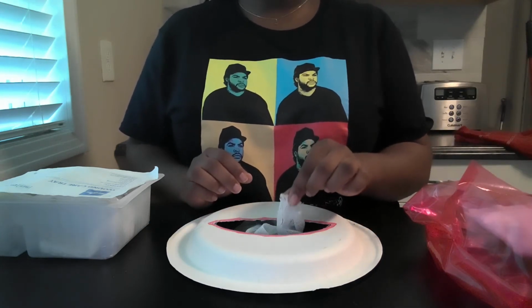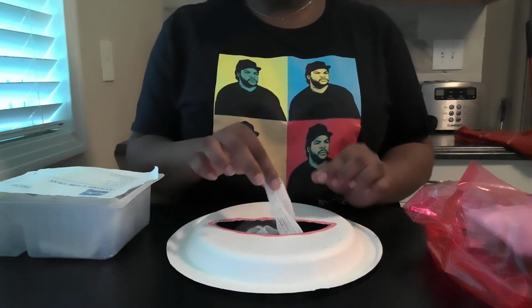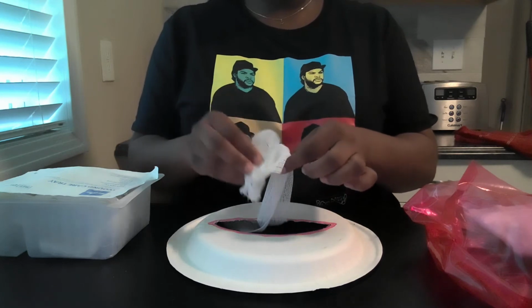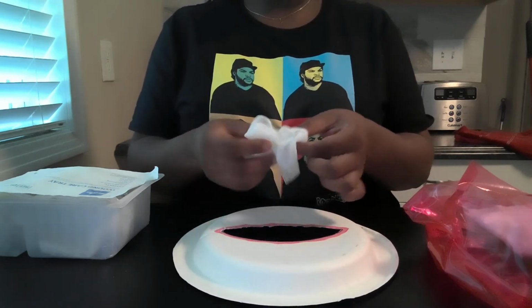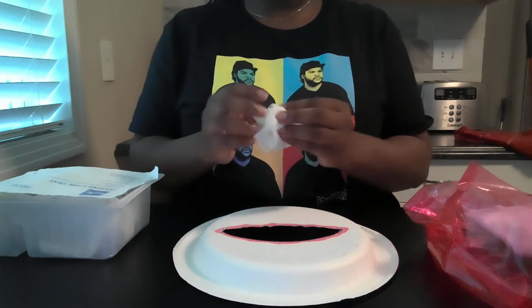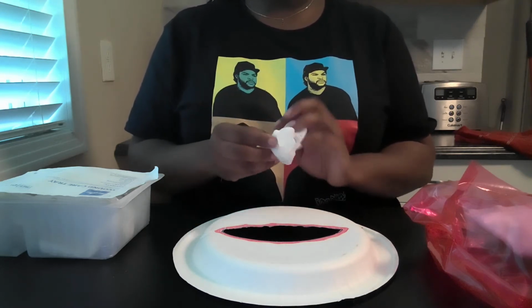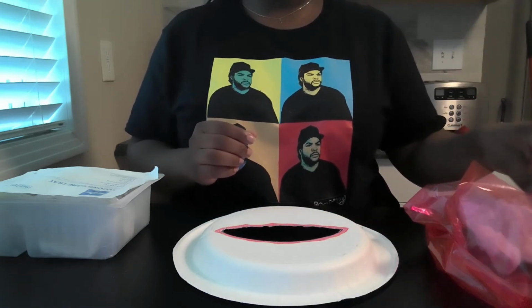Now it's time to unpack the wound. You want to be careful while unpacking the wound. You want to take it out really slowly. Since this is saturated, I'm going to look at it, looking for any signs of infection through the drainage, the odor, and the coloring of the drainage as well. I'm going to throw that away in the red bag as well.